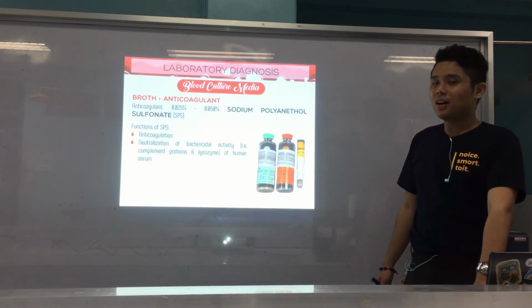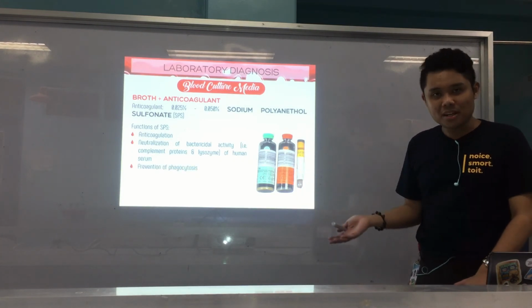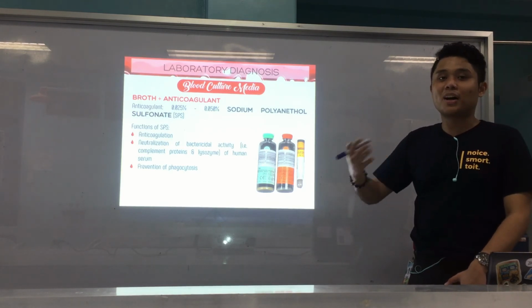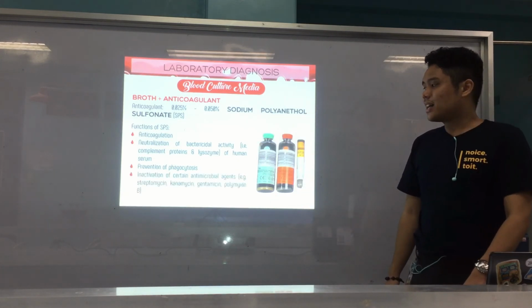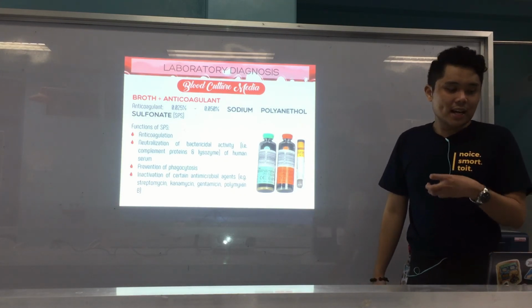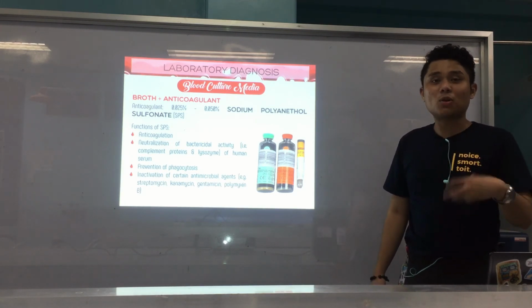Kaya again, mamatay atong kagaw na kailangan i-isolate. Prevention of phagocytosis because again, your blood has WBCs. So, para dili ma-activate ang imuhang neutrophils na mo phagocytize, alright? So, kailangan na SPS. Para again, still the same para ma-isolate ang kagaw. And lastly, inactivation of certain antimicrobial agents if the patient is undergoing antimicrobial therapy na. So, butangan nato siya para again, dili na mo affect to antibiotic sa kagaw. Because again, we want to isolate it.